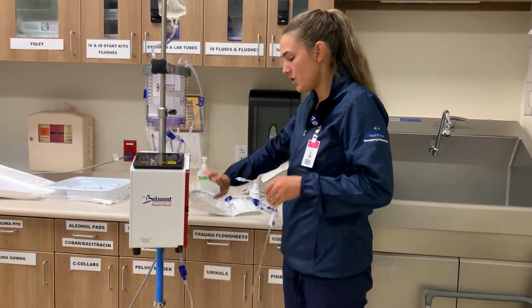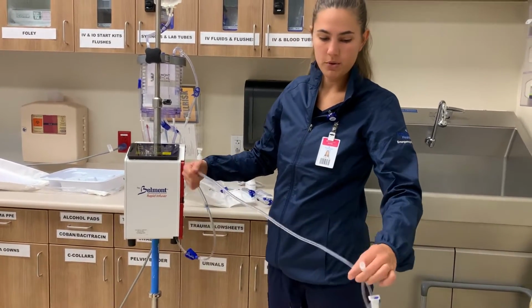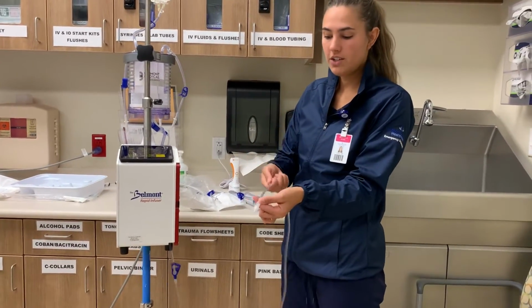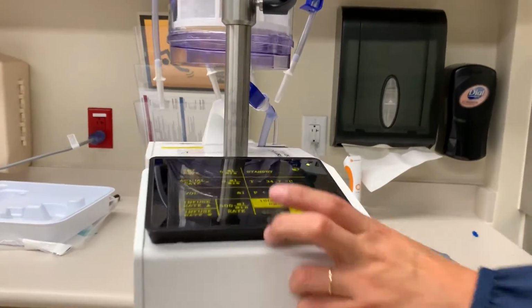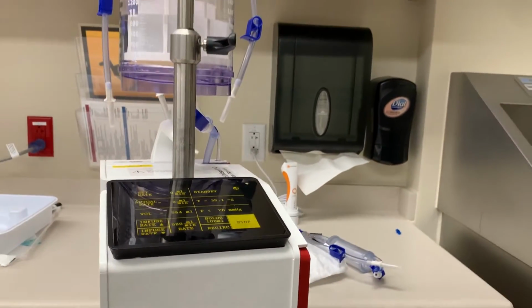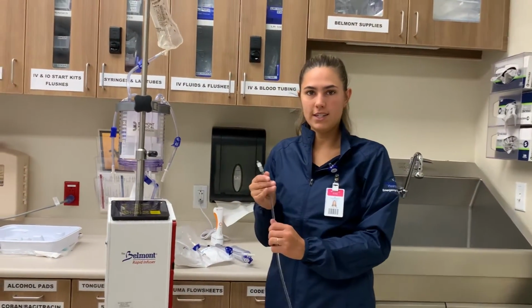However, I'm going to take a look and make sure that there's no air bubbles and that this part of the tubing is still primed before connecting it to the patient. Now I see an air bubble here, so I'm gonna just select this bolus button and I'm gonna let it kind of prime itself out. Now the air bubble's gone, I'll just select stop. Now the tubing looks good, so we can connect it to the patient.